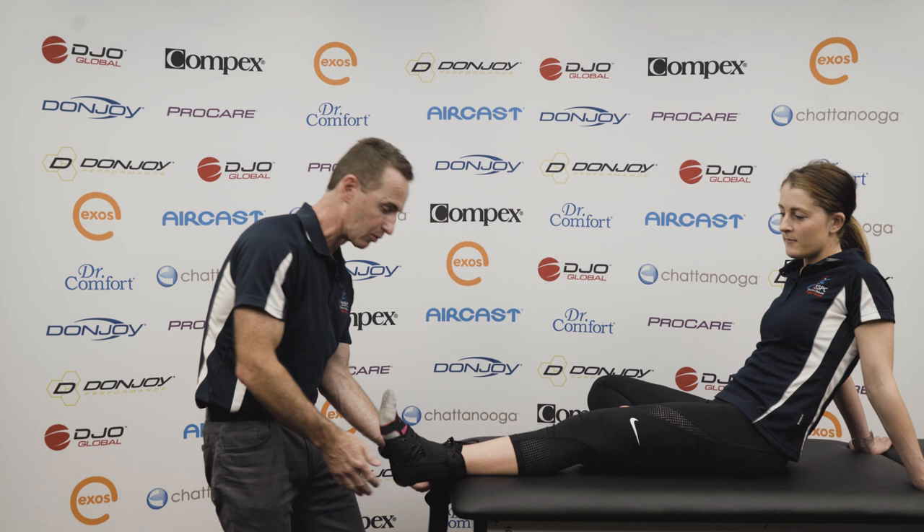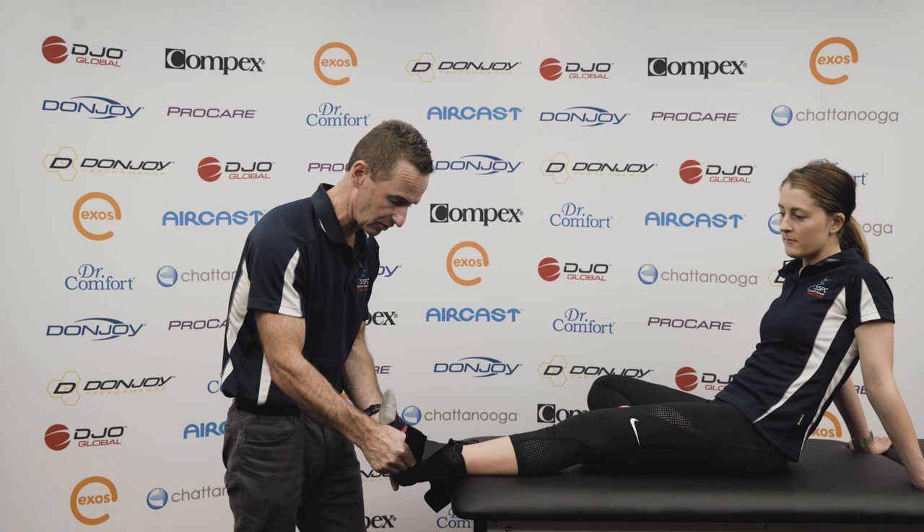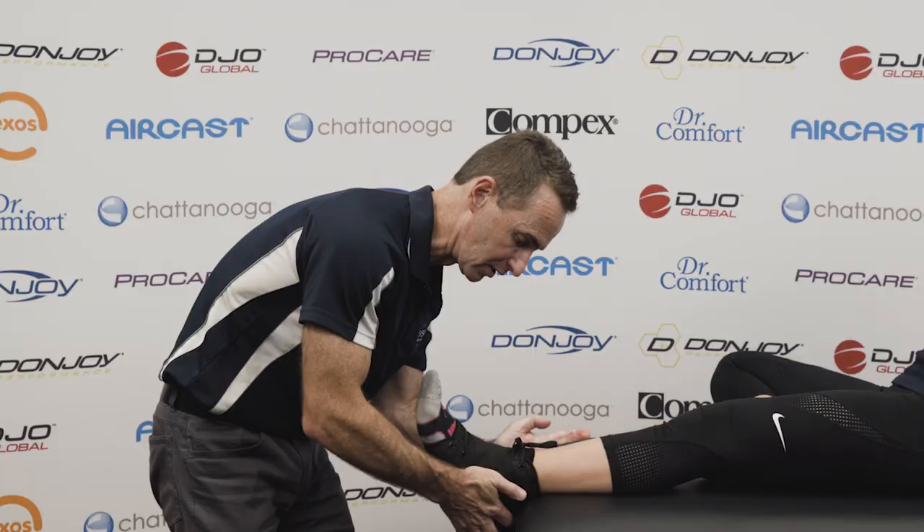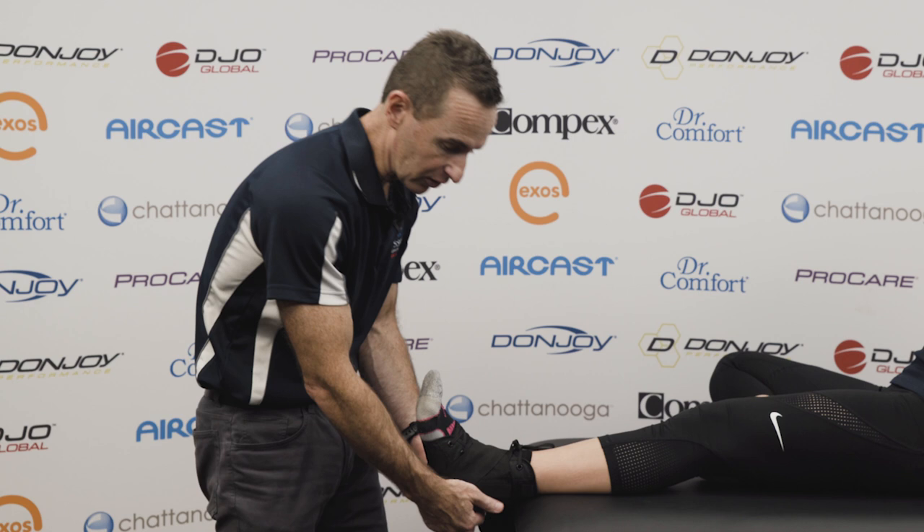We're then going to grab the other longer strap and do the same thing — across the front of the ankle, underneath the heel, and pull up the inside with some nice firm pressure, making sure that the foot is in a neutral position at all times.